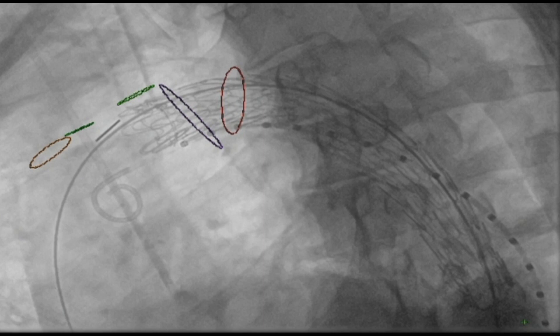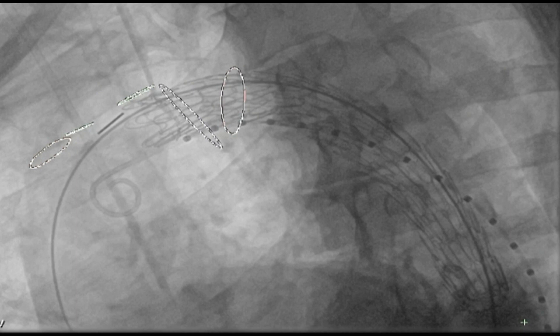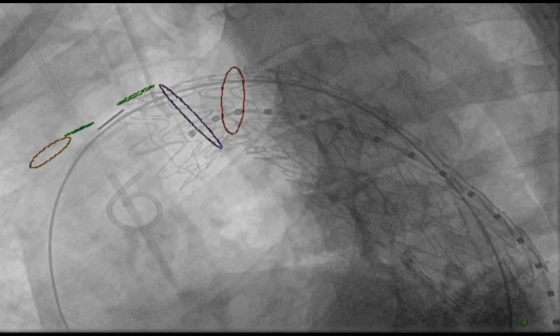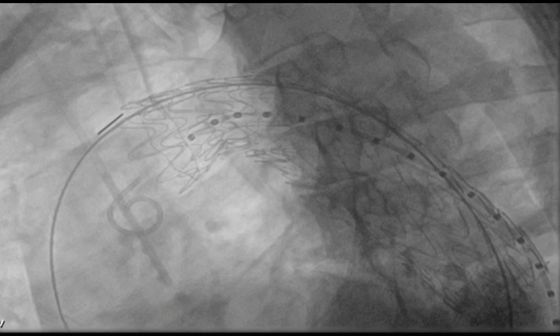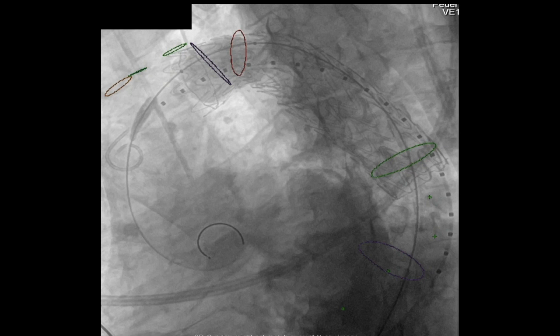The fusion is done by creating a cone beam CT in much the same way as you do CT-to-CT fusion. The device has now been placed and an angiogram performed — partially deployed here, then fully deployed. We did do some angulation of the proximal neck to ensure there's adequate apposition to the inner curve. And then the completion angiogram will show that the stent graft has resulted in complete exclusion of the saccular aneurysm in this particular situation.